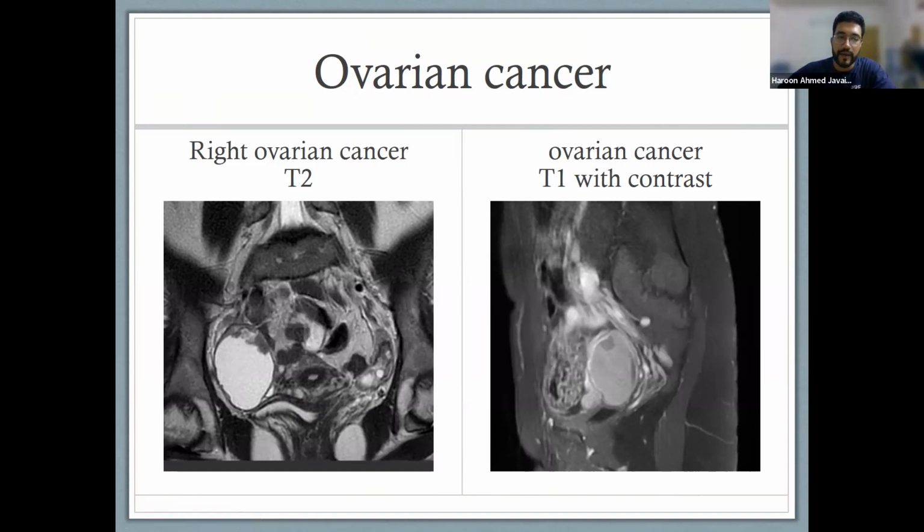MRI. Okay. Now, in the MRI over here, what they see is this is a T2 image, right? So in T2, remember how we said T2 is always without contrast? It's used to look at pathologies, and you would see fluid light up. So over here, what we see is there's fluid that's lighting up.